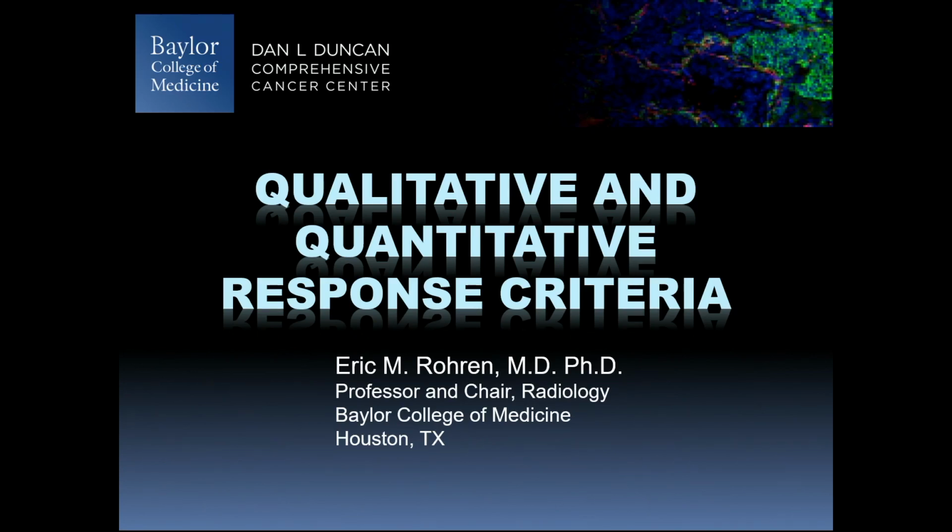So I want to convey what's happening to the patient, and I'll use descriptive terms. And when necessary, you can call the clinician and talk to them. Frequently, they'll call and say, I read your report, but do you think the tumor is getting better? Is it worse? They need to decide what to do with their patients.